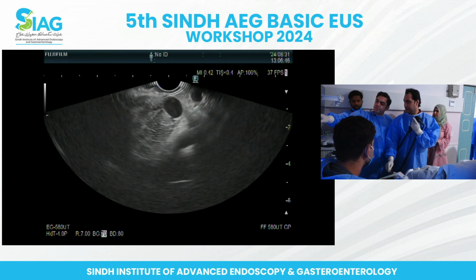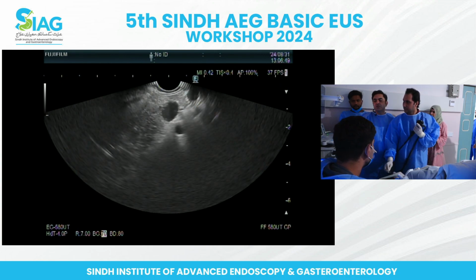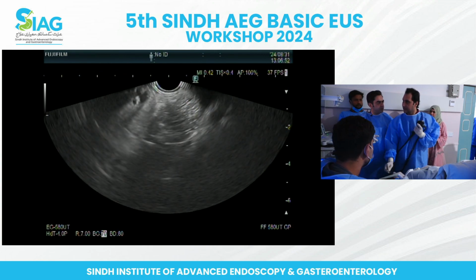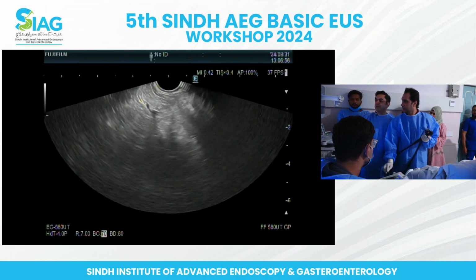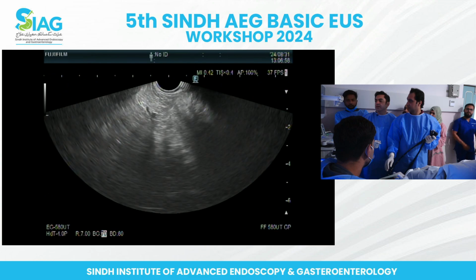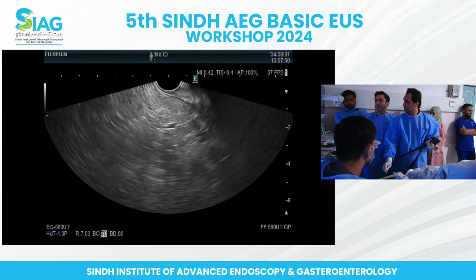Barely, yeah. Okay. So do you want to spend a couple of minutes in the duodenum before we go to the lesion? Okay. We'll just do a bit of the duodenum now. We'll go to the duodenal bulb.